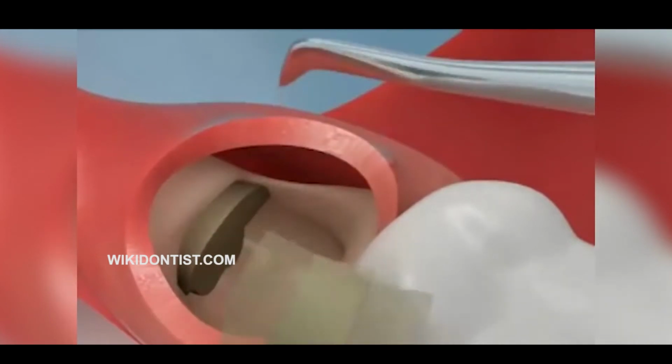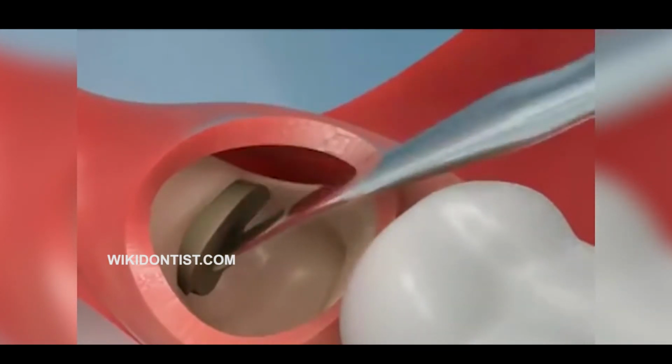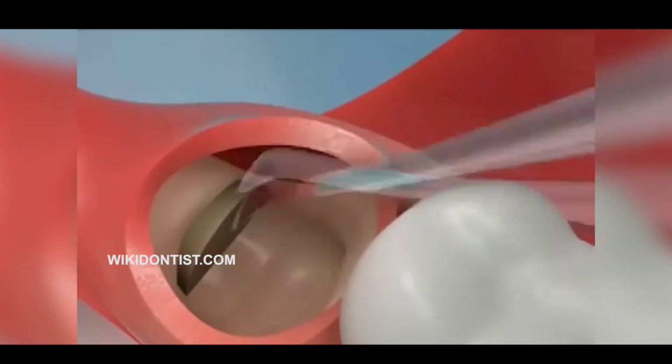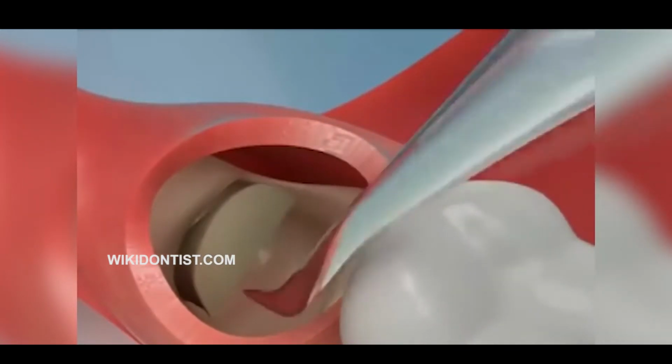We remove the crown first because there is no space for the tooth to come out just like that; otherwise we would have to cut the bone. So we cut the tooth crown first and remove it, and then slowly nudge the root after making it into small pieces and remove it. Once the tooth is fully removed, the bone can be seen as it was. As you see in this x-ray, the bone is fully there. We don't have to take it out.